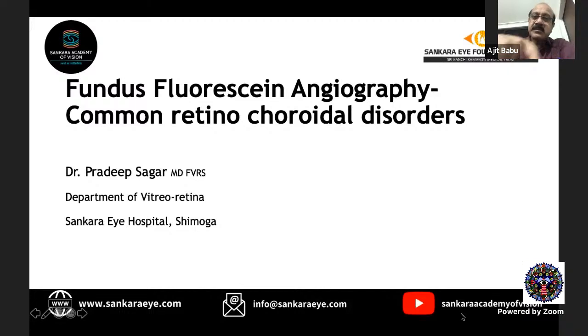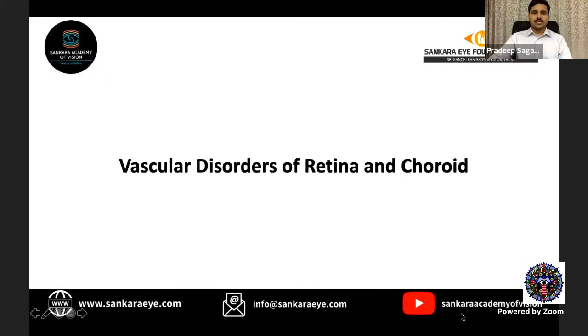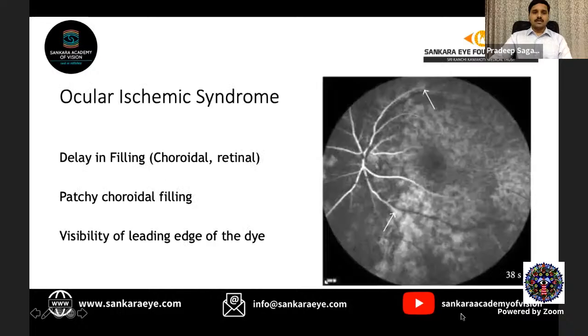Thank you, sir. At the outset, again, I would like to thank iFocus, Santosh sir, and all the senior faculty members for giving me this opportunity to present my talk. I'll be continuing with the second part of my presentation on fluorescein angiography. Today, I will be mainly discussing the angiographic characteristics of the common retinochoroidal disorders. To begin with, the vascular disorders of retina and choroid. First, I will be discussing ocular ischemic syndrome.